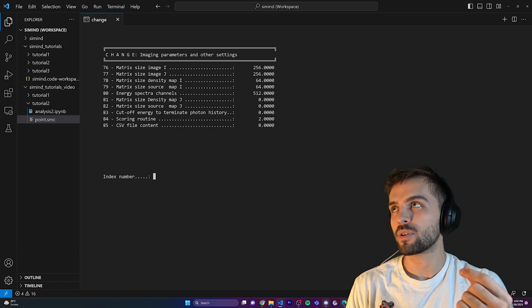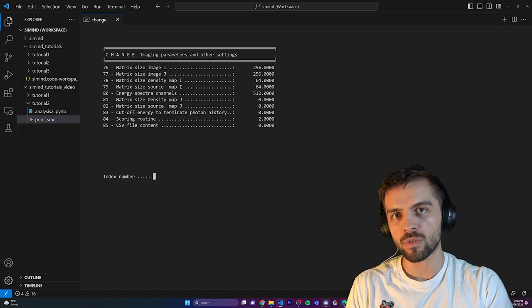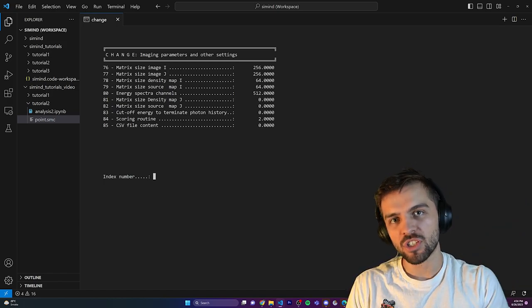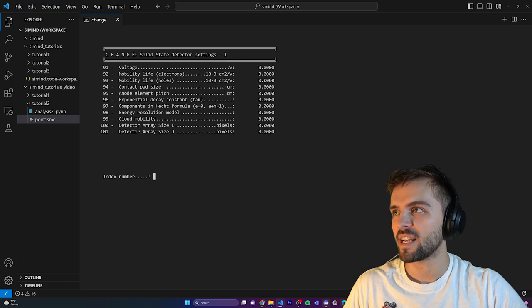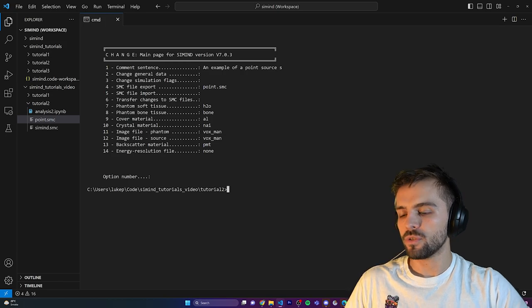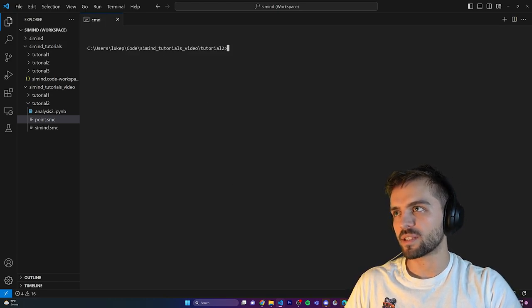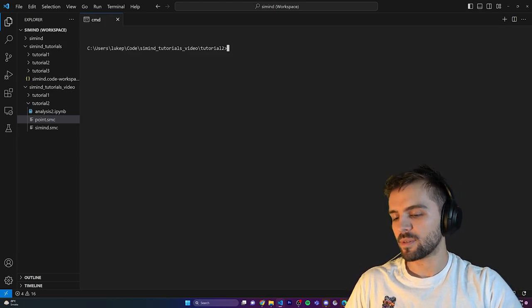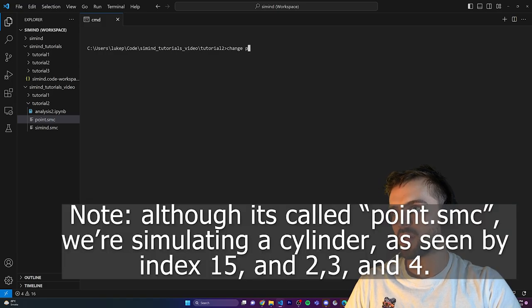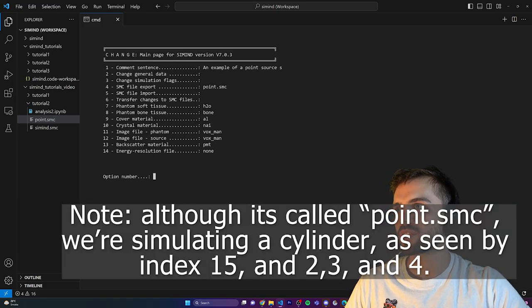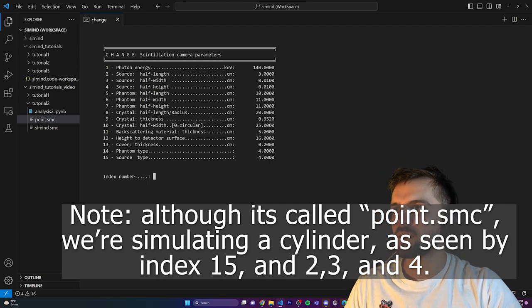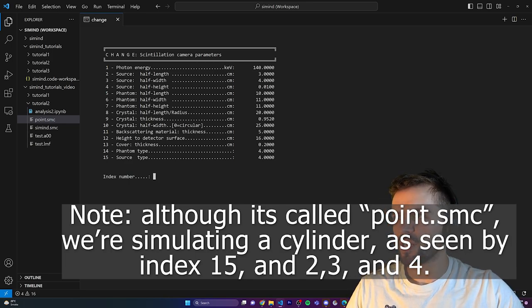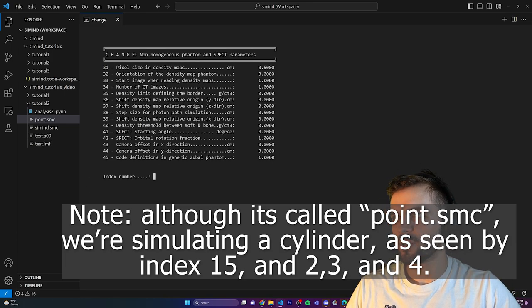A real scanner will predict an energy value and a given position for a photon. We can look at this list mode data to understand the SPECT system. Before running the point simulation, I'm going to permanently change some parameters: index 2 to 3 centimeters, index 3 to 4 centimeters, and index 4 to 1 centimeter.